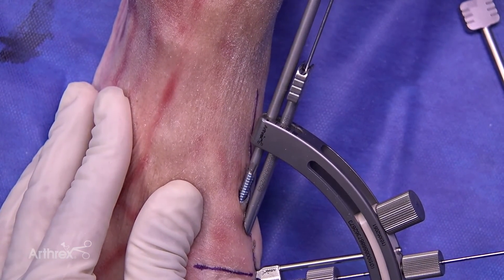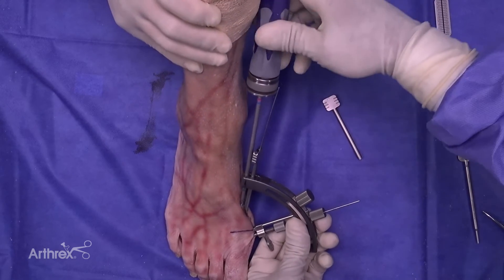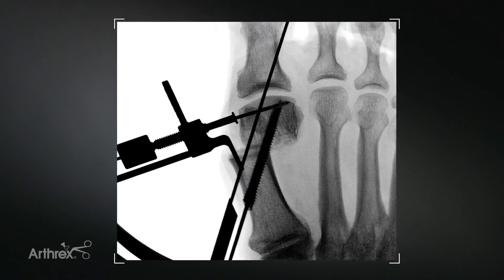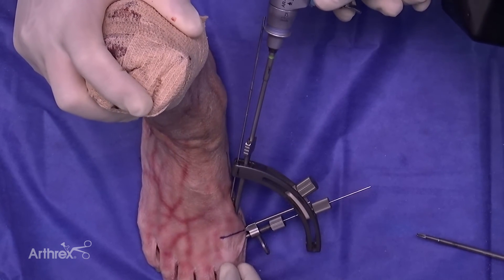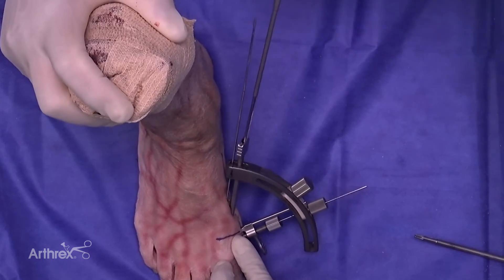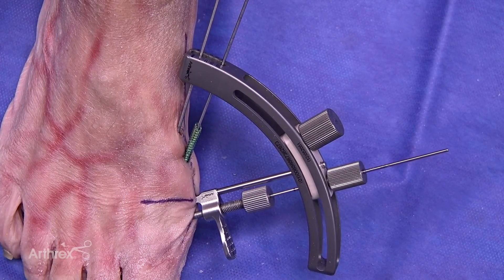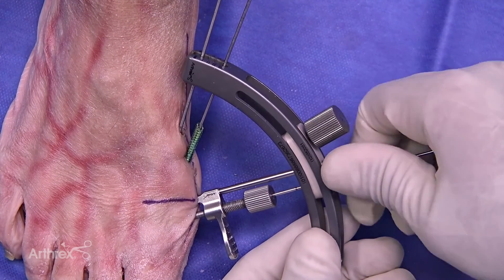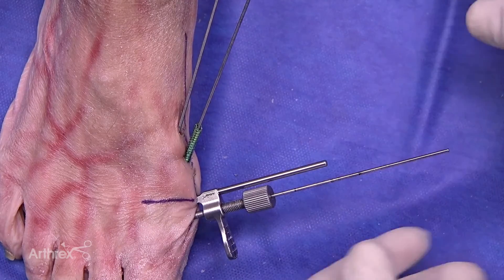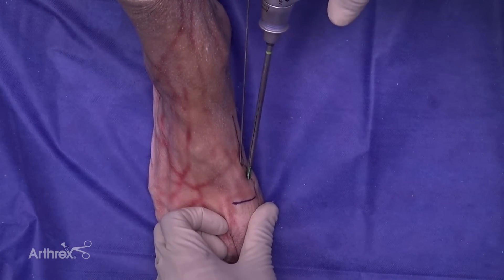I like to advance the screw on power and make any final adjustments with the hand driver. As you can see, the bevel lays very nicely along the medial cortex. Sometimes due to placement of where the screws are, you may find that a portion of the screw abuts the guide. However, our proximal screw is maintaining our position so we can remove the rest of the guide to finish the fixation. With the guide removed, we can finish completing the fixation.